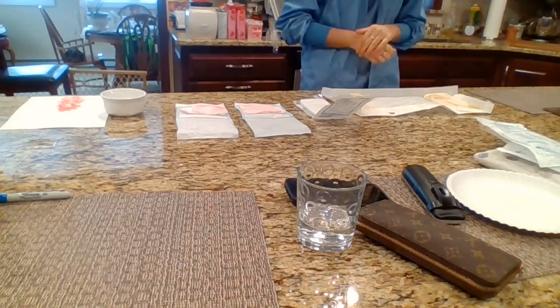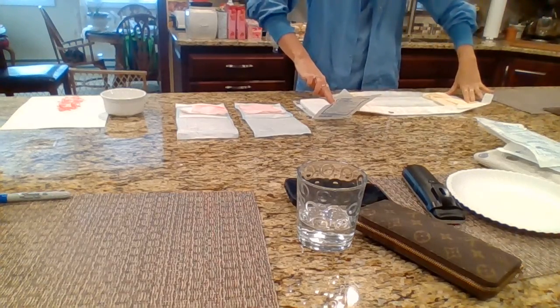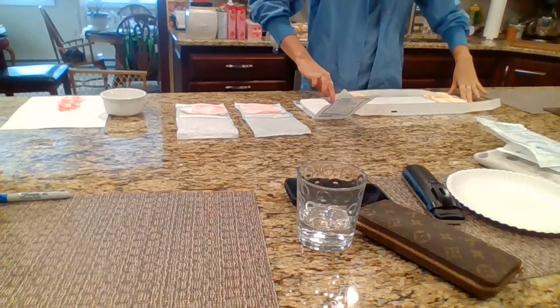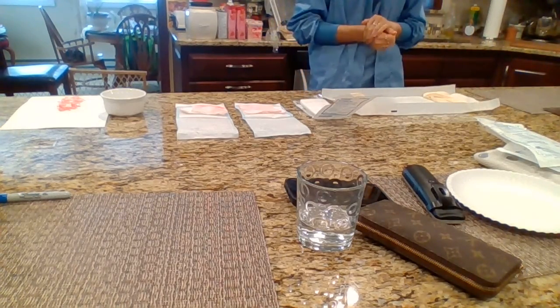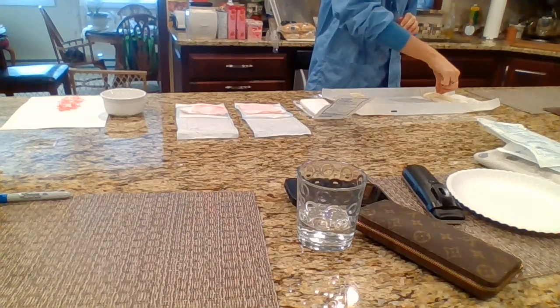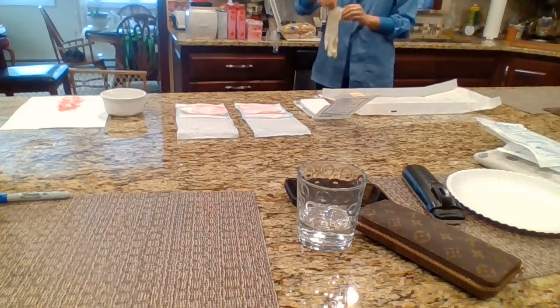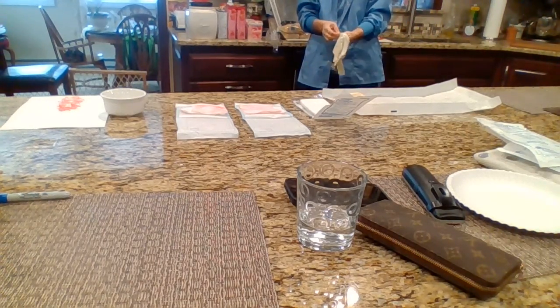So after that is folded down the best that it can, it doesn't need to be perfectly folded. But after I get that down, what I would want to do is, starting with my left hand, I'm going to grab the right cuff. Going to take a step back, keeping my arms above my waist. I'm going to slide my hand in there.